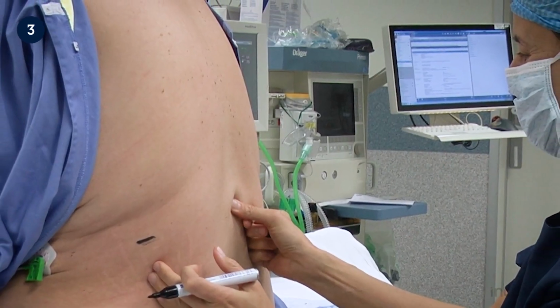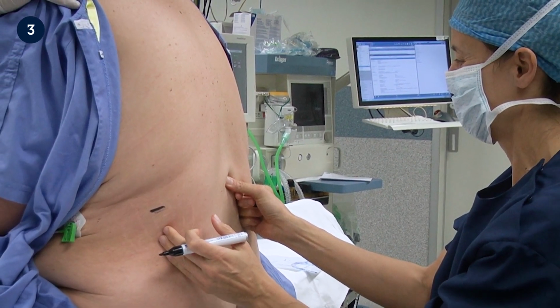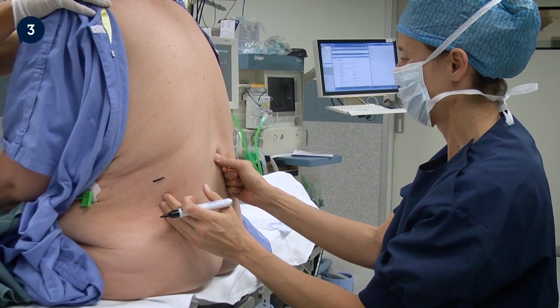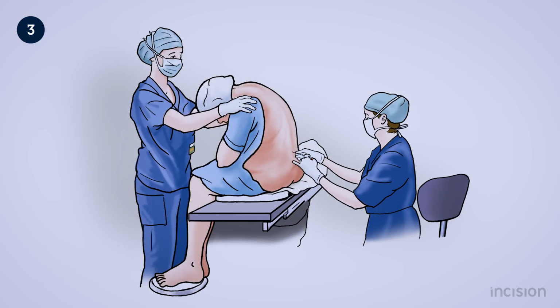Administering a spinal anesthetic very much relies on patient positioning. Positioning the patient in lumbar flexion, either lying down or sitting up, satisfies these conditions. In this film, spinal anesthesia is demonstrated with the patient seated. A schematic will now be used to demonstrate what should be done to optimally position the patient.